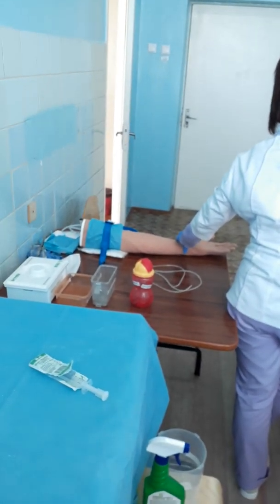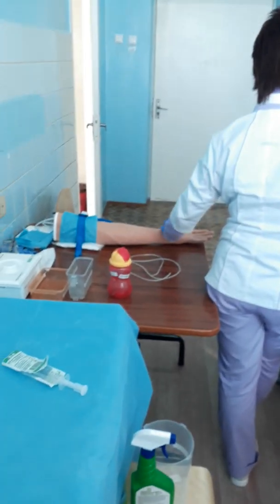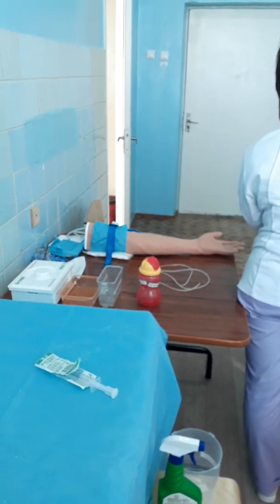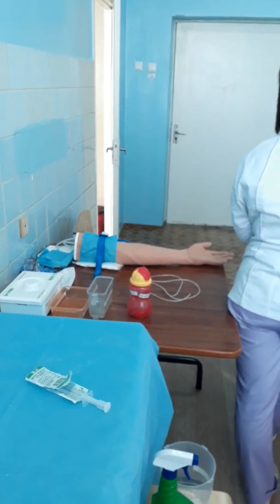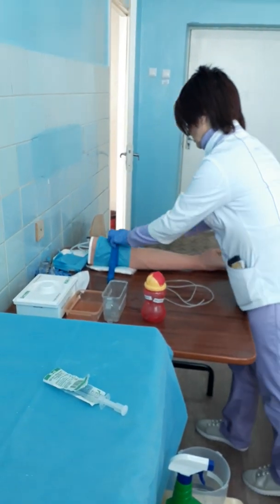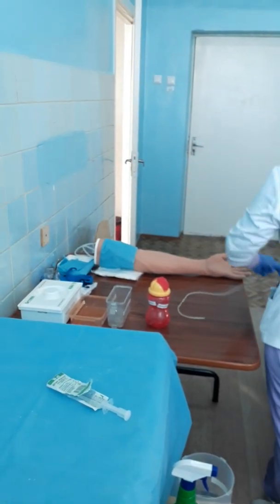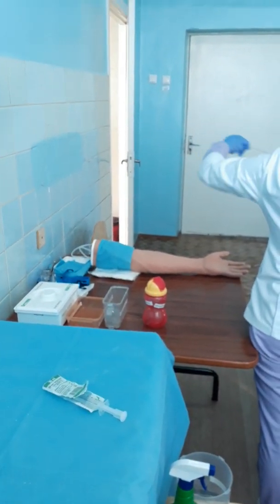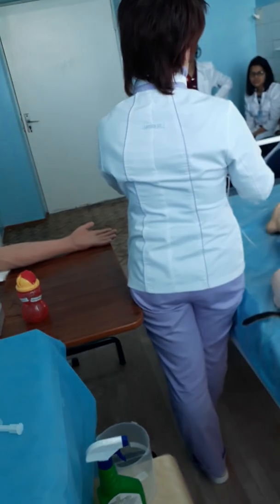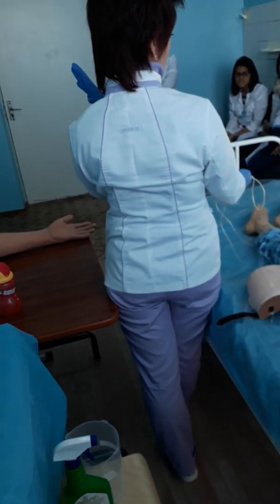This is only a tourniquet for venous. It's not a tourniquet for stopping bleeding. And if your pulse is present, you do it, and the venous will be more full. Or, if you don't have a special device, you must use this tube. You can remove it with only one hand.